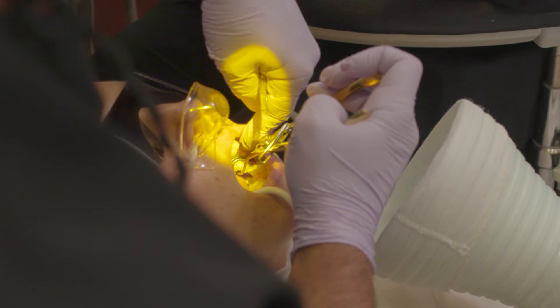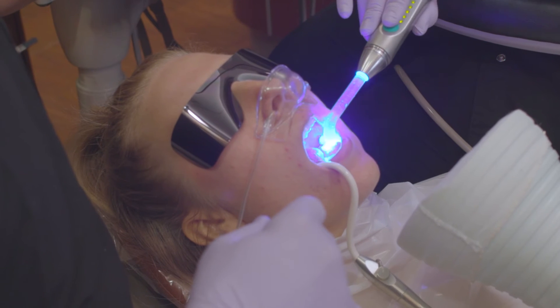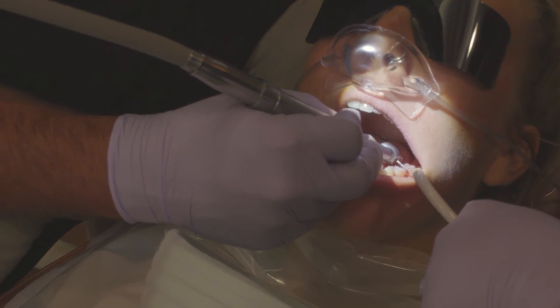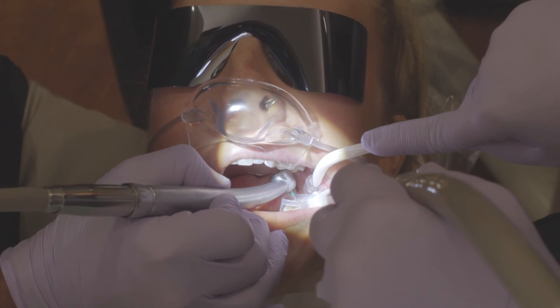We also use what's called a chunk-out technique, which is a specific method for removing mercury-containing fillings. Instead of drilling directly into the filling and creating a lot of spray and gases, we go around the outside of the filling, creating sections like puzzle pieces, and remove the filling encapsulated in its own form. This decreases the amount of overspray and vapors produced.